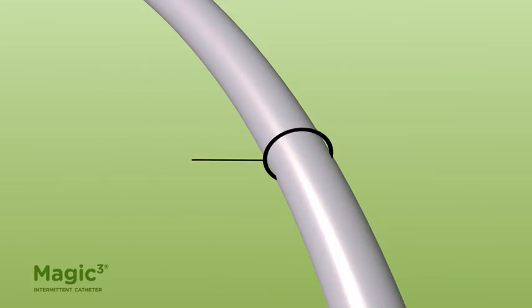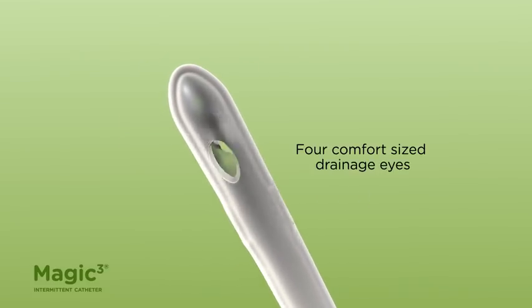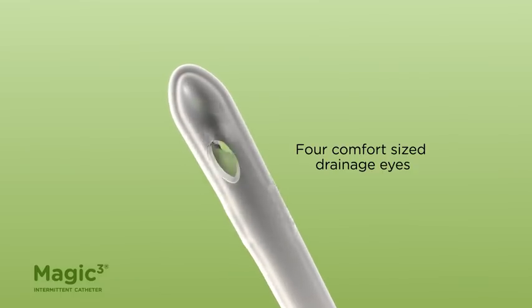The catheter is available in different diameters, or French size, and lengths. The catheter tip is tapered and has four comfort-sized drainage eyes for ease of movement over sensitive areas.